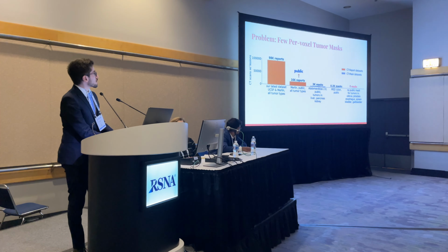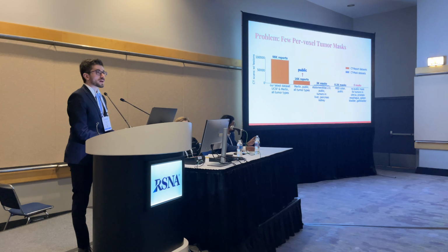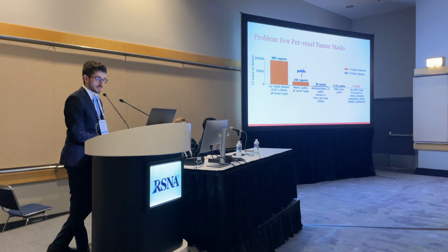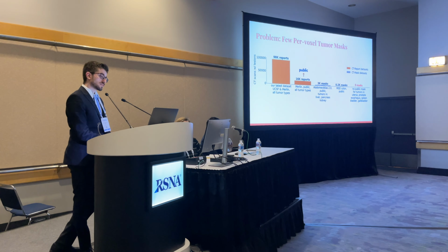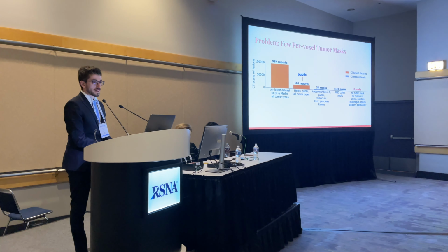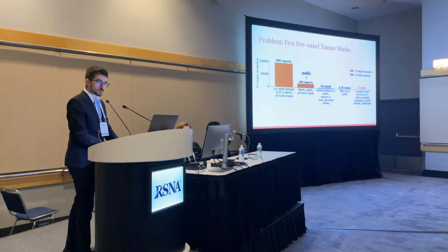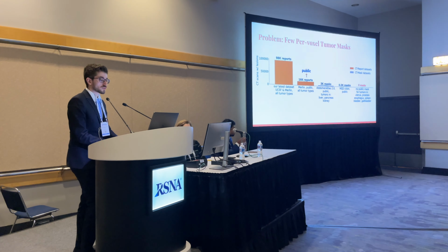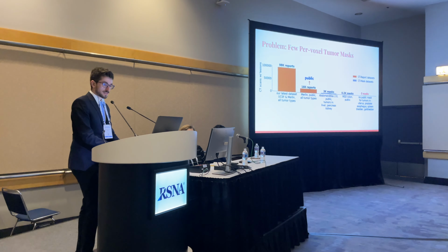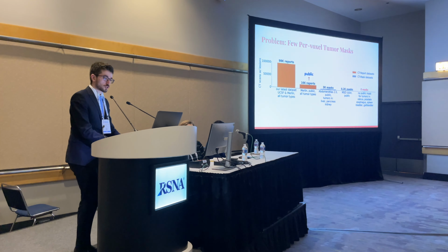So what's the problem we're dealing with here? The problem is that for tumor segmentation, we have very few tumor segmentation masks, especially in public data sets. If you look for kidney, pancreas, and liver tumors, you can find about 1,000 masks for each in the largest public data sets. However, if you look for other tumor types in CT scans, like uterus, prostate, esophagus, spleen, bladder, and gallbladder, you can find no public masks for these types of tumors. And this is a big problem if you want to train a tumor segmentation model.